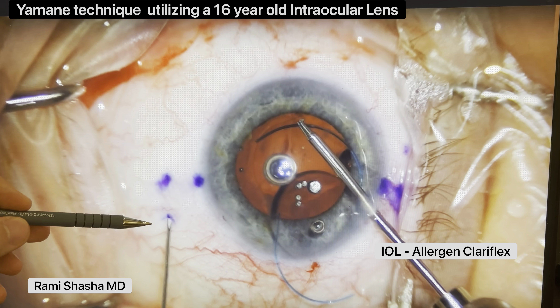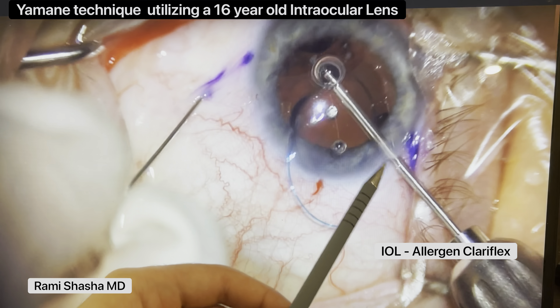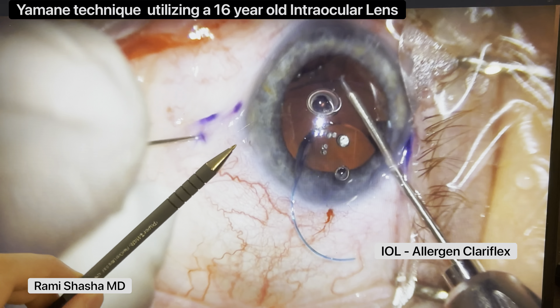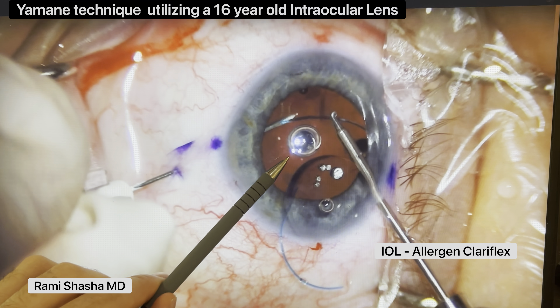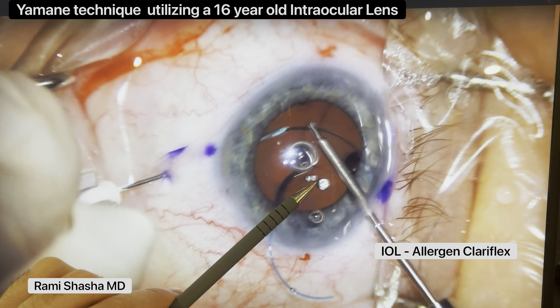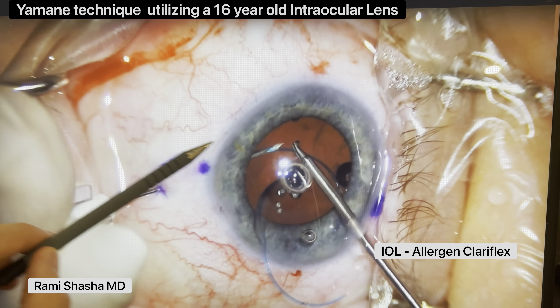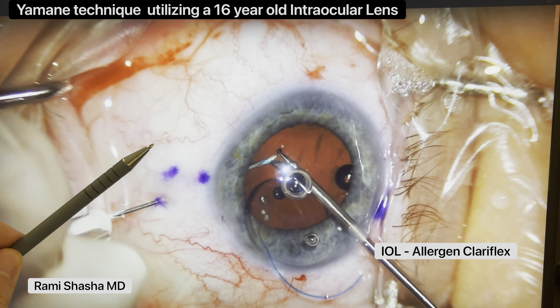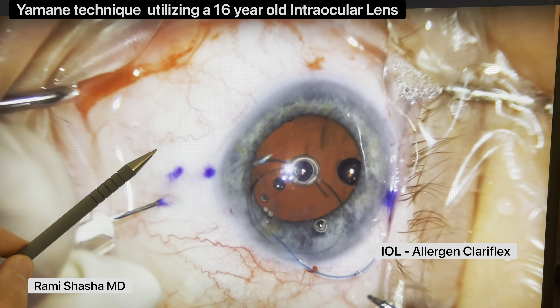Here's my 30-gauge TSK needle. I've got my micrograsper in my other hand. Now, these are PMMA haptics, so I'm going to be very mindful of the possibility of kinking. The needle actually goes in fairly nicely and fairly smoothly. Sometimes I'll keep the needle inside the eye, but for this specific case I decided to externalize the haptic — I vary my approach from one case to another. I'm just feeding a little bit more, being very gentle because of the PMMA haptics.